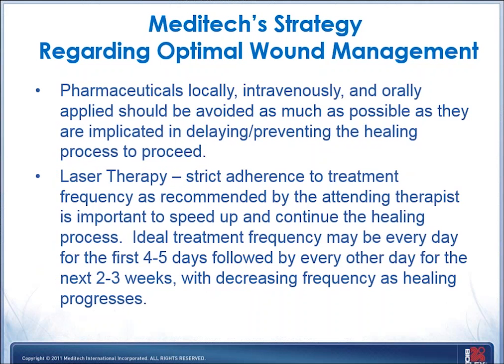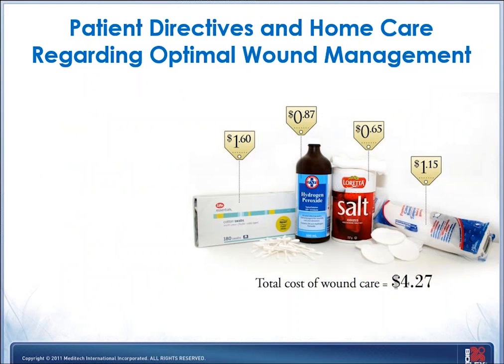We always encourage our patients to step away from any pharmaceuticals, locally in particular, because that creates a kind of breeding soil for bacteria, especially the non-medical ingredients of those topical creams and lotions. And then apply laser therapy strictly, directly over the affected area. In the beginning, we suggest treating aggressively on a daily basis, just to give that initial boost to the cells. Then we space out those treatments to three times a week, twice a week when necessary, and then the final phase of healing down to once a week.